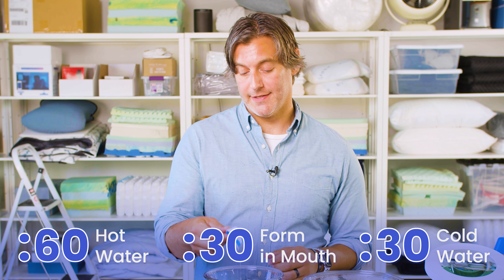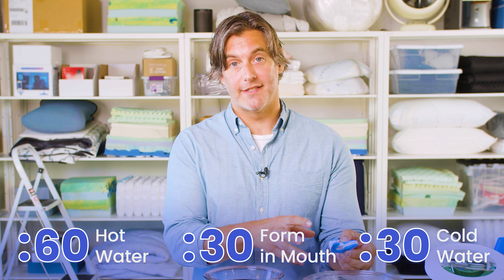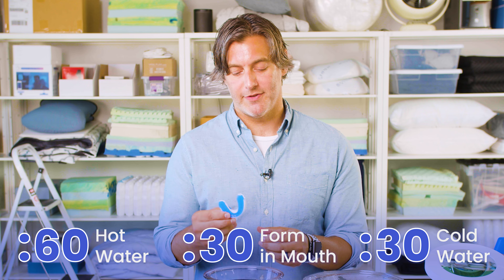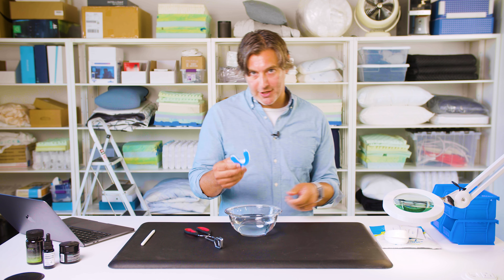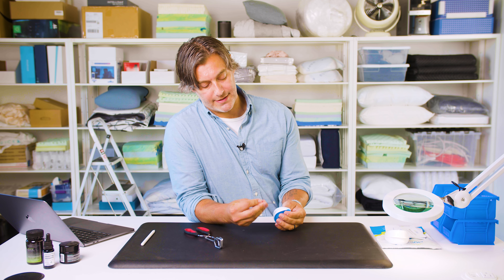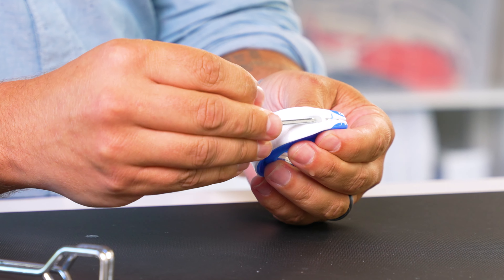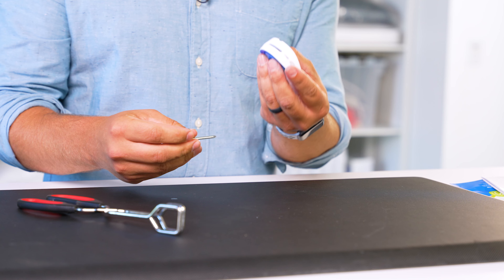Now it may take a few tries to get this right. Don't feel afraid to dunk it back in the hot water for 60 seconds and re-mold it to your mouth. Maybe it will take a time or two to get the fit just right. Once you have the mold formed to your teeth, you can make additional adjustments. This is designed to make additional adjustments to your lower mouth, so you can take this Allen key and tighten or loosen these screws on the side to provide an additional fit. It's going to take a little bit of trial and error, but once you have the fit just right, you should be good to go.